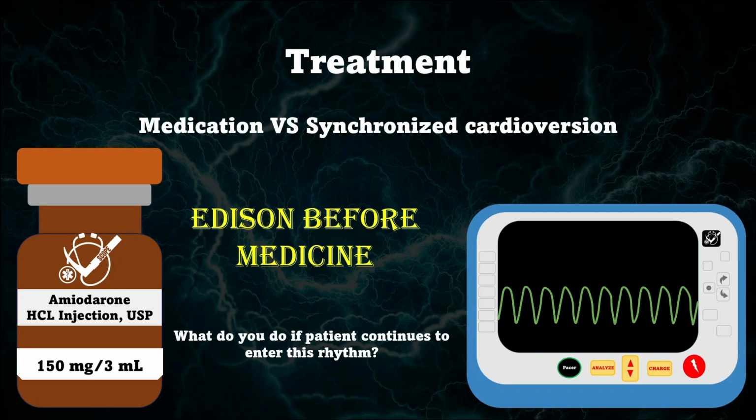Now let's talk a little bit more about synchronized cardioverting. When you synchronize cardiovert someone, it is the same process as defibrillating a patient. However, you must make sure you hit the sync button to synchronize the monitor to the rhythm. A little tidbit of information here, because the monitor will shock a patient at a certain time when in sync mode, you might need to press and hold the shock button until it is delivered. So in this patient, we cardiovert the patient into a sinus rhythm.